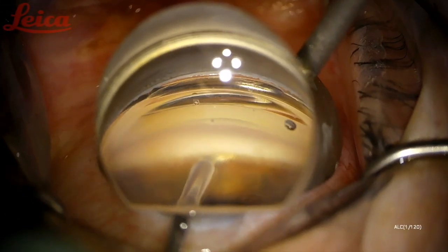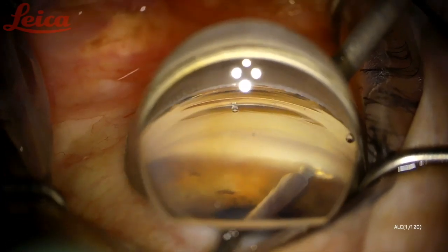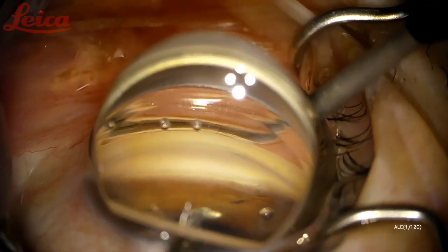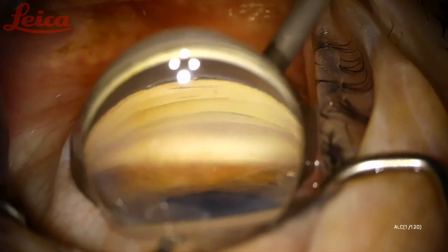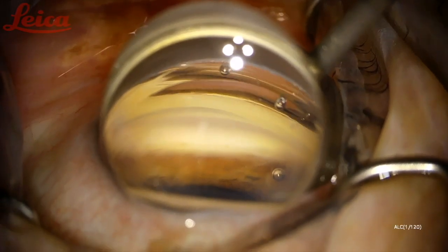This is just another example of the nice wide goniectomy that you will get with the trapezoidal design of the Trab-X blade. It fits to the canal of each patient to allow for optimal TM excision. You can see that back wall of Schlemm's canal bright white for about three clock hours here. This looks good.